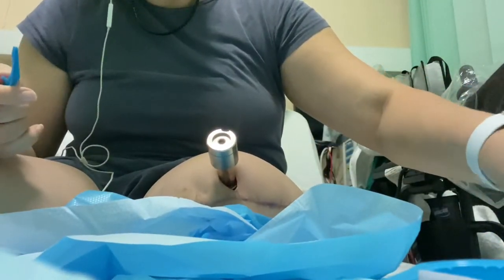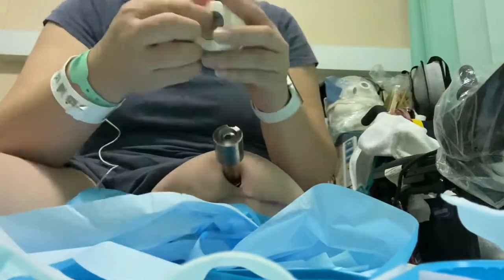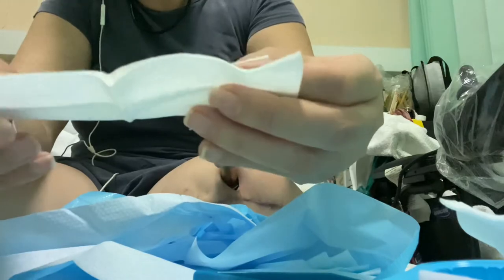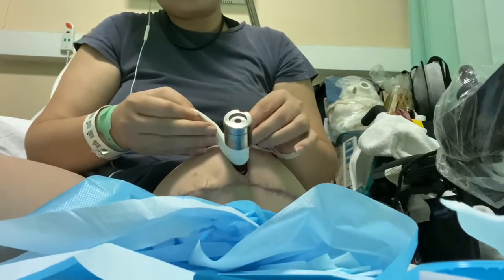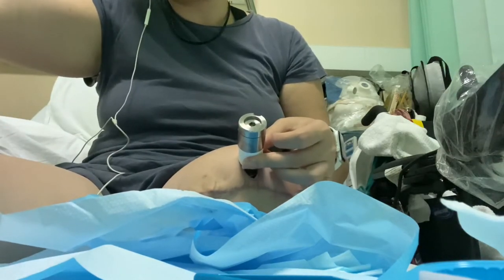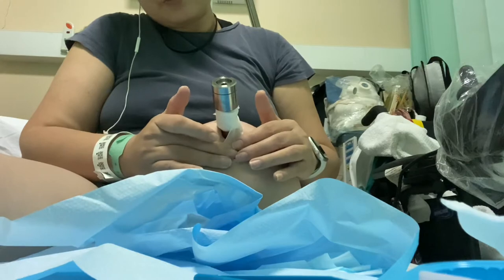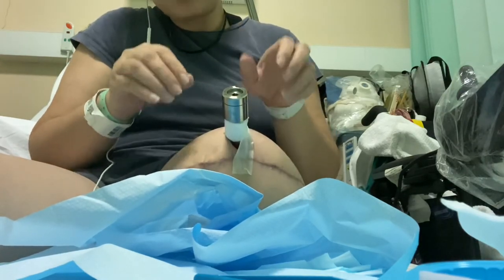The last tray — I have a few gauze pads here. And then I have to make a little tape. I fold it, and then I just put it here just to let it catch some liquid. I still have some liquid discharge, like blood and then some clear. The reason I put it here is the hole is a little bit bigger, so I can hold it, and I hope it can pull it up.